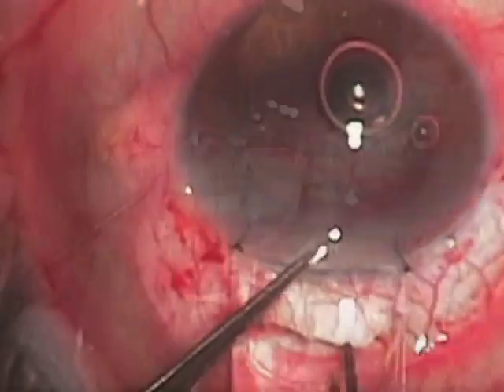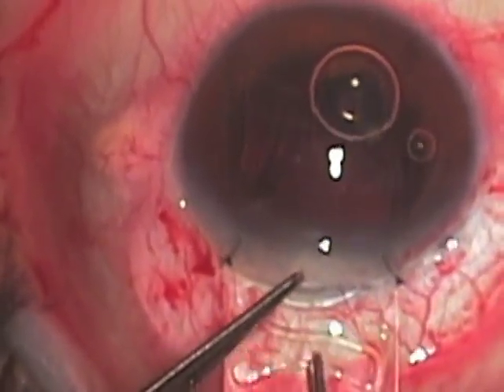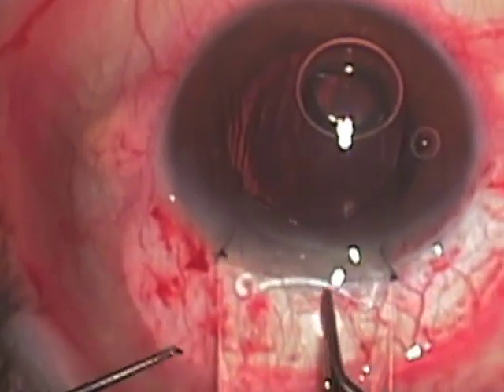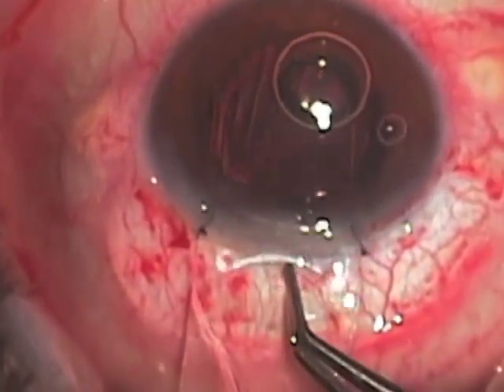The lens is an Alcon multi-flex anterior chamber lens and is directed carefully over the sheets glide into the chamber, and then the glide is removed.